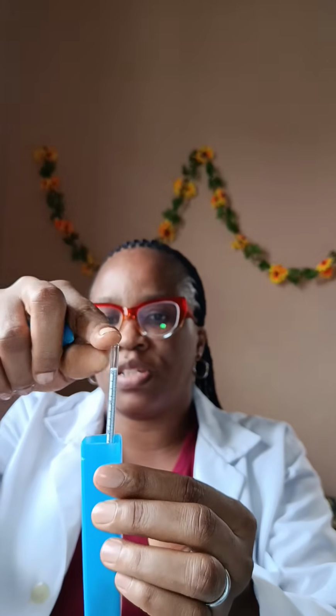I don't know if you can see it. Just the way it is, it should not be touching the body; it should just be floating on its own. Then you read the upper meniscus. You take the reading at the meniscus level. When you dip it, you'll be able to see the upper meniscus level. You take your reading. That is how simple it is using the urinometer.